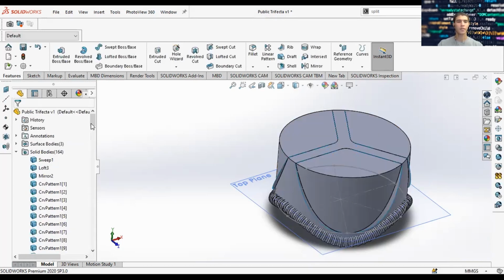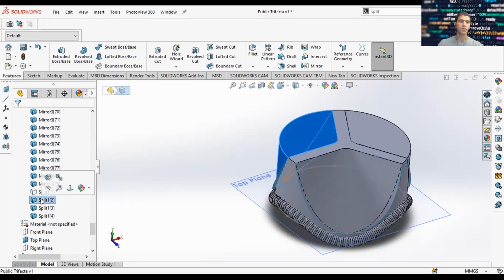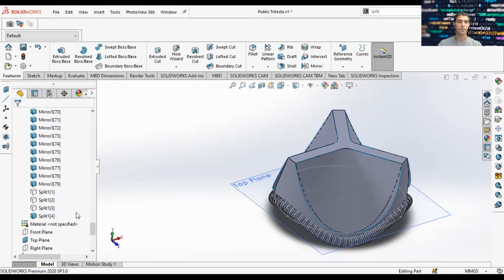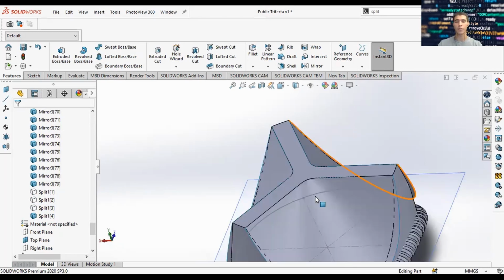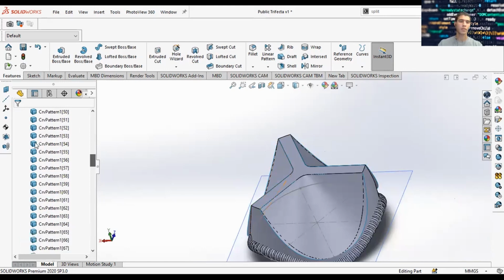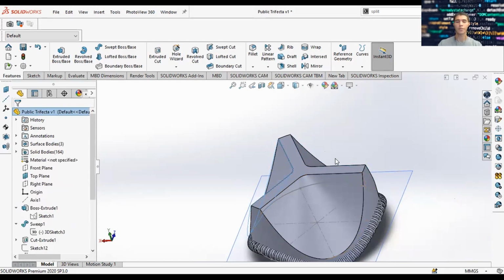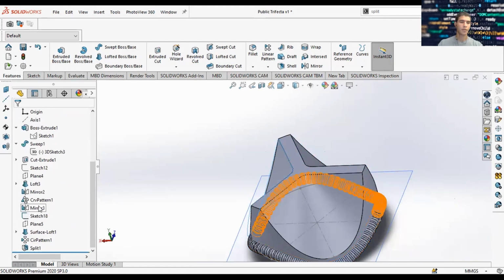And notice now, our solid bodies include 4 split bodies at the bottom. And so we have split 1, let's hide it. Split 2, let's hide that one. Split 3, and split 4. And so we got our cylinder and split it to remove the bodies we didn't want, or to remove those cross sections on top. And now that we have surface bodies, let's remove that. And we'll just keep the solid bodies that we want to work with. Another sketch here.